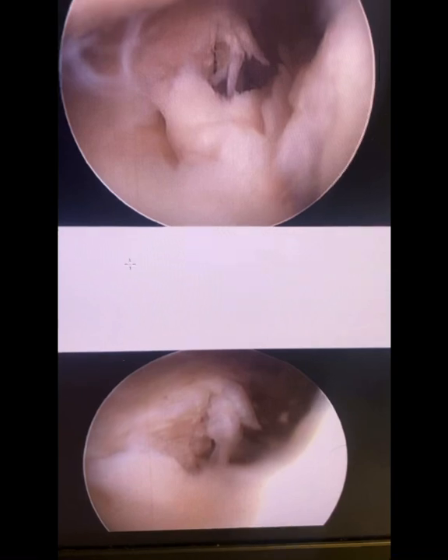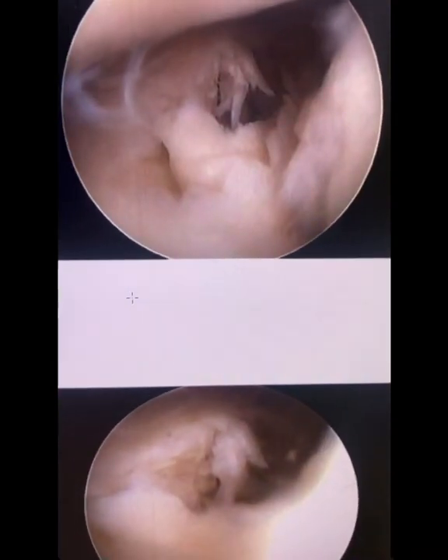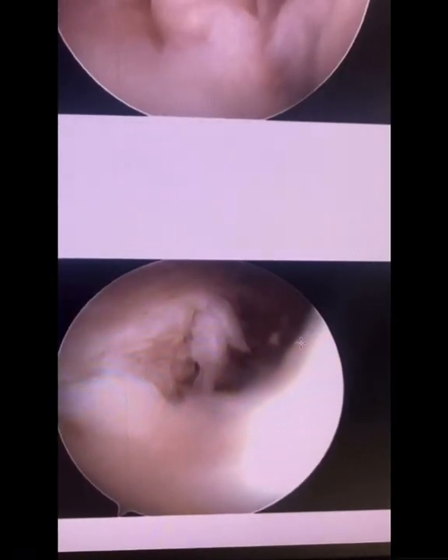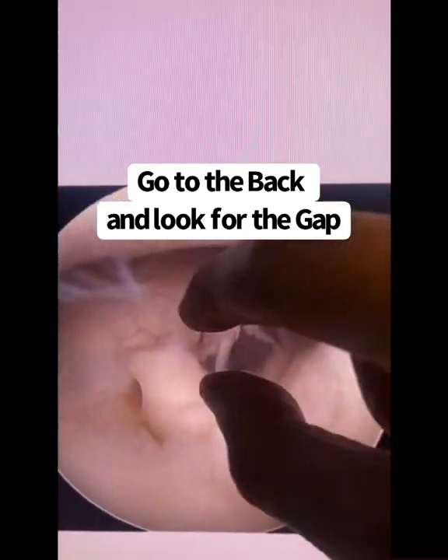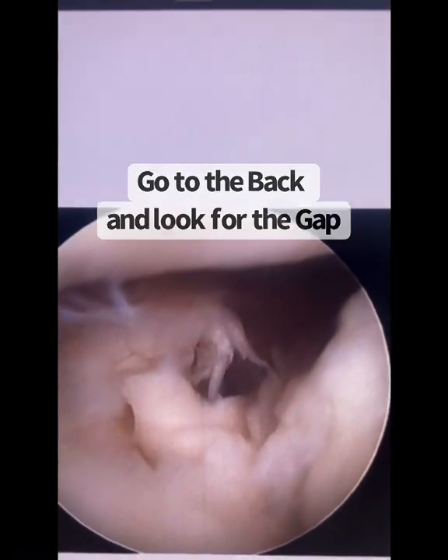These are the arthroscopic images. This is actually the tear right here — it's a great illustration of a root tear. We're way in the back of the knee. This is where the meniscus attaches to the bone, but the tear occurred right here and there's a separation or a gap. When I teach about root tears and you're doing arthroscopy, you've got to go to the back and look for the gap — and there it is, with shredded tissue right there.